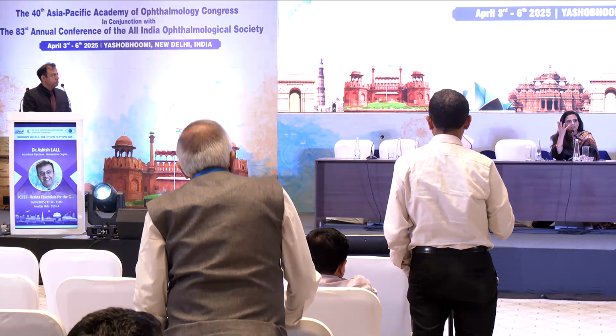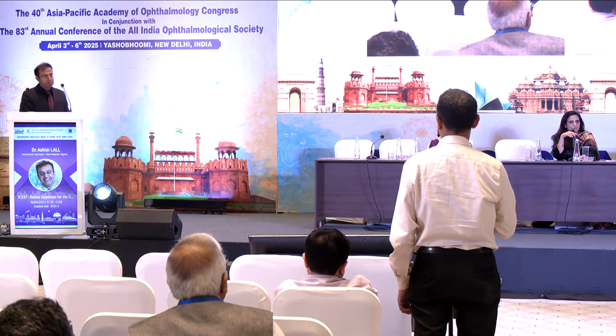Regarding the IOP rise, a good trick would be to ask the patient if he can see the light. Sometimes on the table itself, the patient will not be able to see the light. That means your IOP has shot up a lot, and in those cases you would need to do a paracentesis. Otherwise, generally it doesn't happen. But always ask the patient at the end, can you see the light or not?